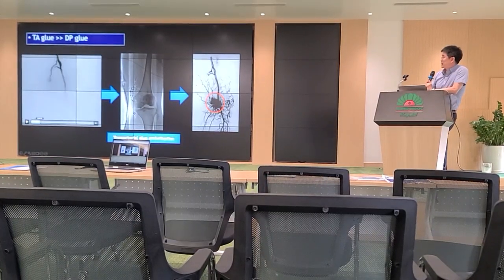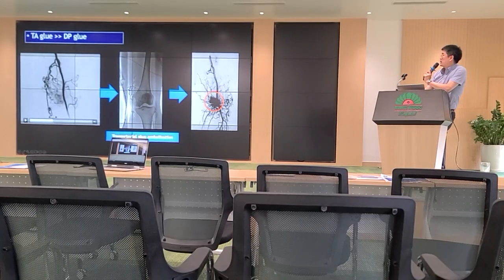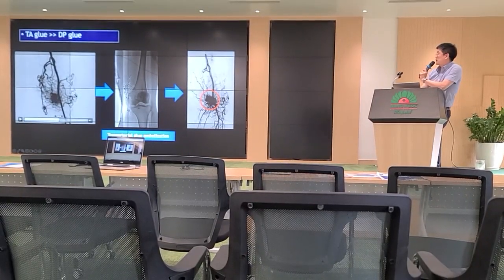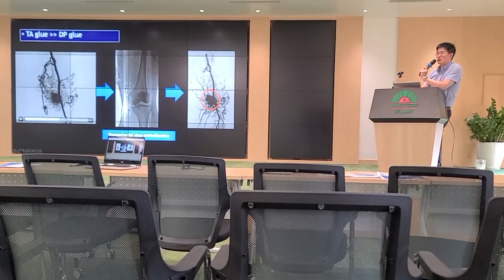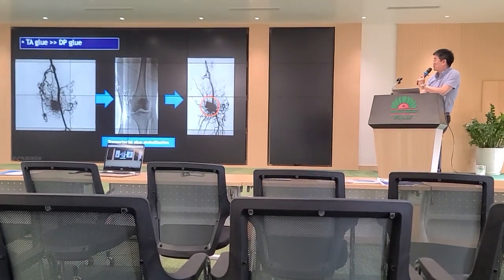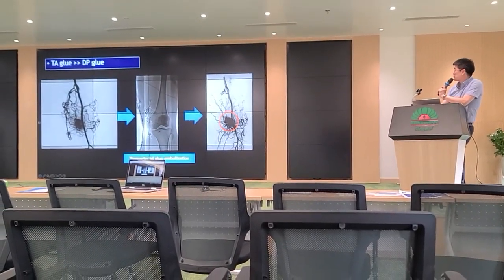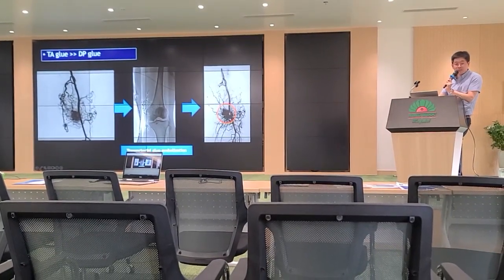This patient had a knee AVM. You can see numerous feeding arteries joining into this vein. At the time, for preoperative embolization, I used transarterial glue embolization, but the glue did not reach the target vein. So this is the angiography after glue embolization. Still visible AVM.